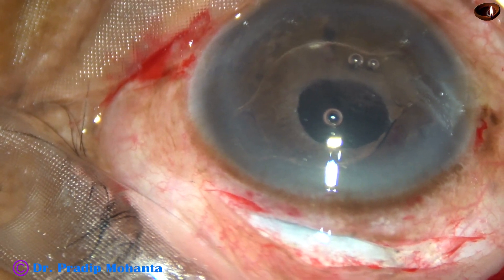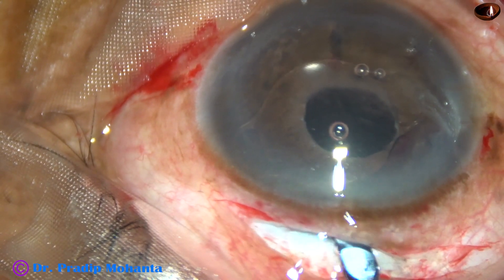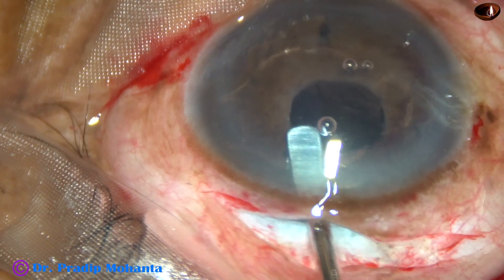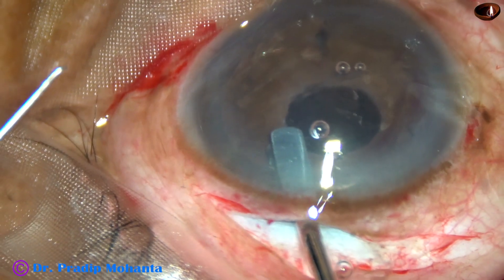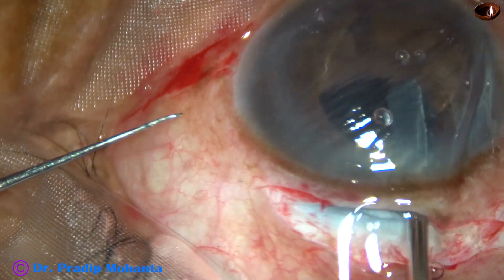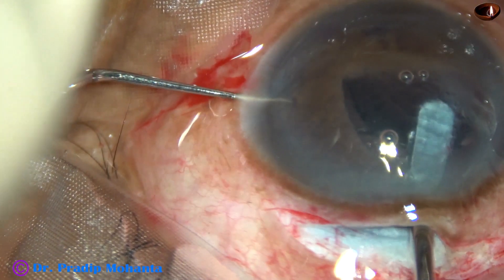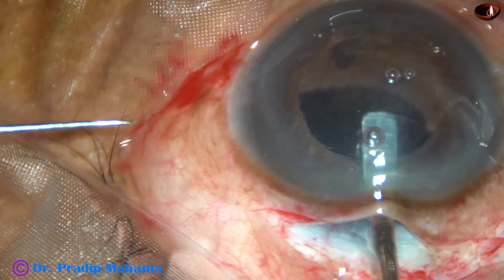I have an iris holding forceps — a stout forceps — to hold the lens. And now I am going to tuck the haptic at 3 o'clock, enclave the haptic at 3 o'clock first. This haptic goes behind the iris. And now I tuck the iris in the haptic. And it is done.